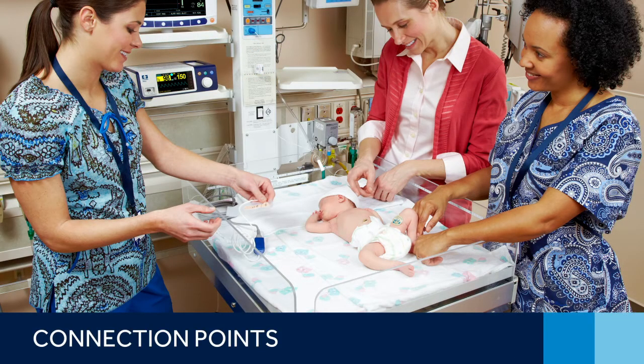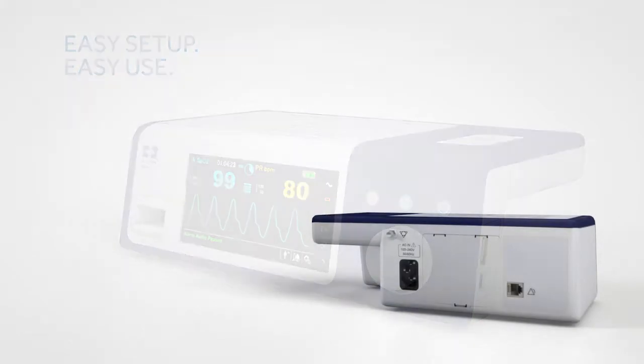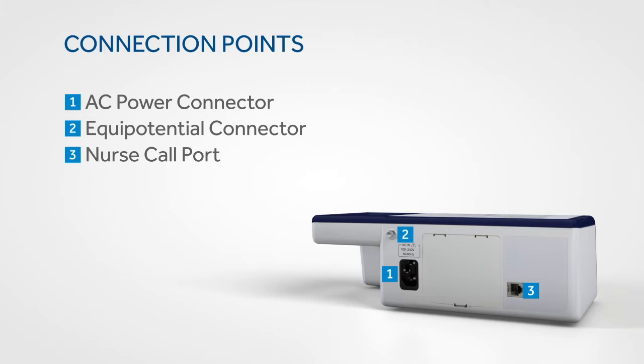The Nelcore bedside SpO2 patient monitoring system is designed for easy setup and easy use. On the back of the monitor you'll find connections for AC power, an equipotential connector, and a nurse call port. The rear panel also offers access to the monitor's battery.